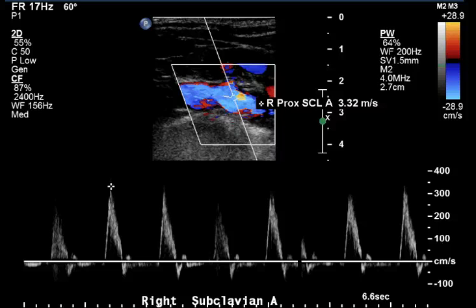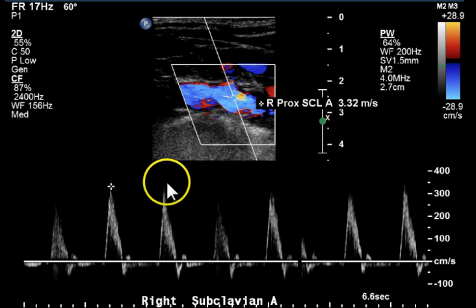This is an ultrasound study of bilateral carotid arteries. The first image demonstrates the right proximal subclavian artery. This is a normal triphasic waveform, and perhaps even a quadraphasic waveform.